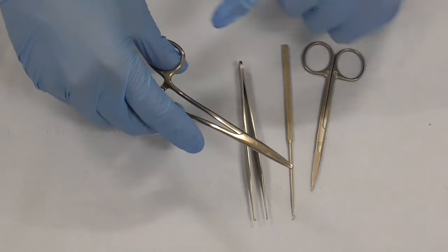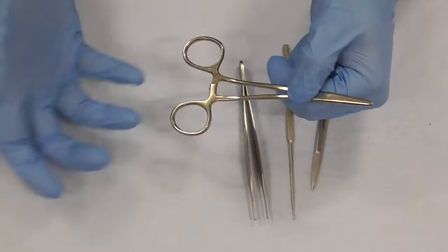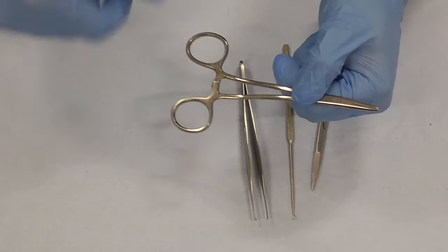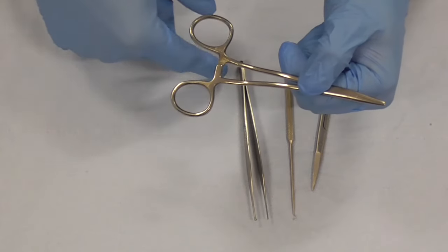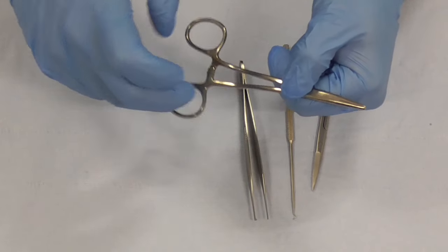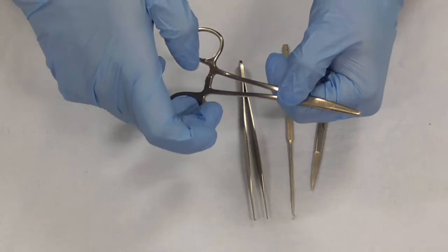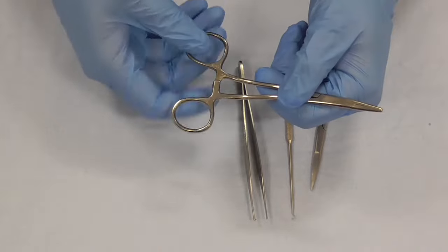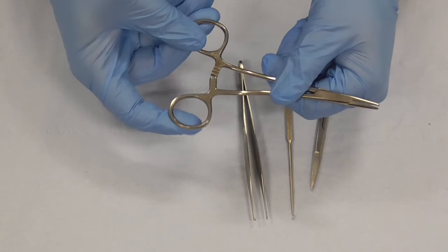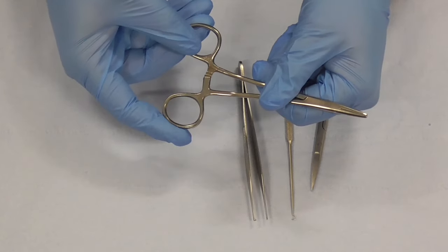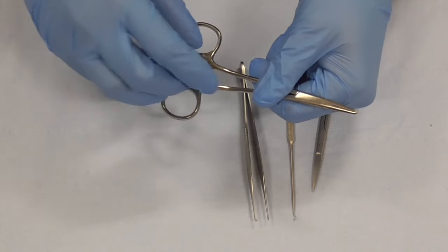When you want to release it you need to push, if I may take my hands away, push the one that your thumb is in away from you and the ring that your ring finger is in pull it towards you so that you open it like that. That takes a little bit of practice but once you've done it a few times you will get the hang of it.